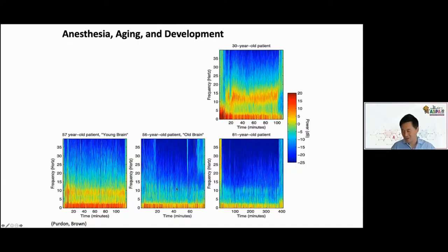One other thing I just thought I'd mention now, because many of you probably take care of adults as well. The smaller alpha wave in the older adult also correlates with increased incidence of postoperative delirium. There's a paper, Gutierrez et al., that same group from University of Chile in 2019, that initially reported this for subsyndromal delirium. And then more recently, Suzanne Koch and Claudia Spies from Charité Hospital in Berlin reported this year, I think also in Anesthesia and Analgesia, that relationship between small alpha waves and postoperative delirium. Just thought I'd mention that, kind of useful information.